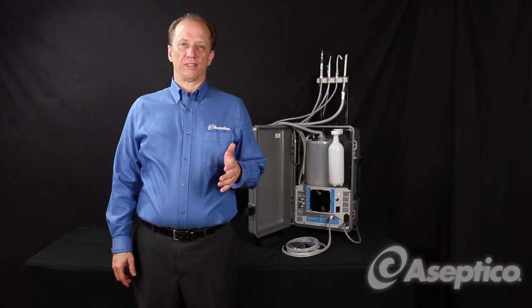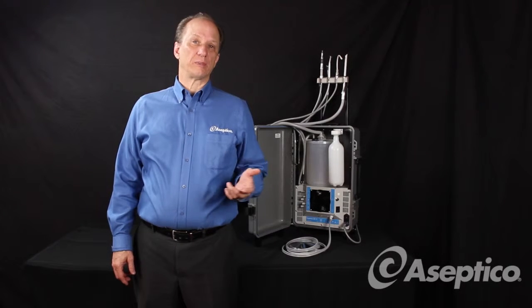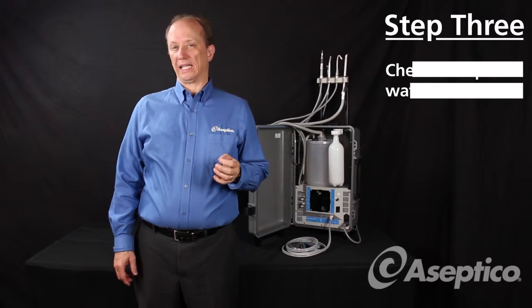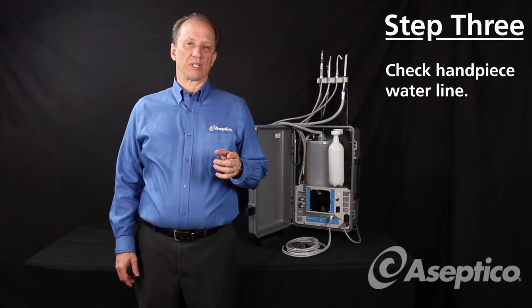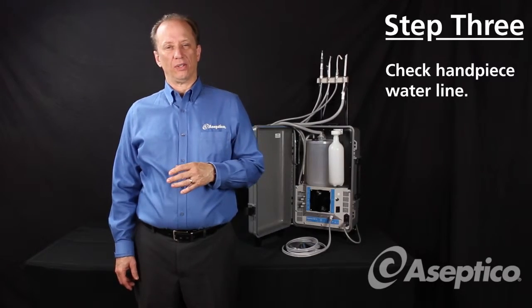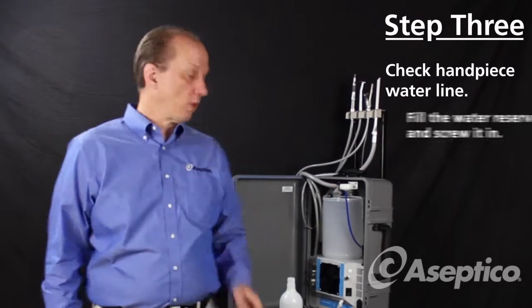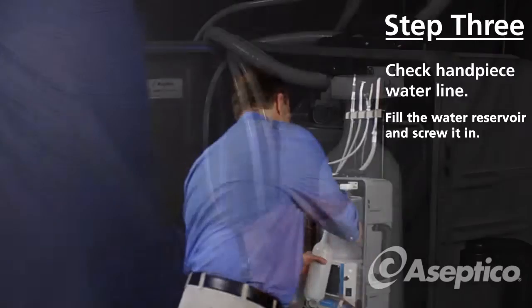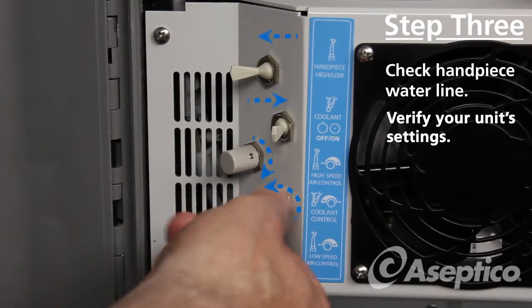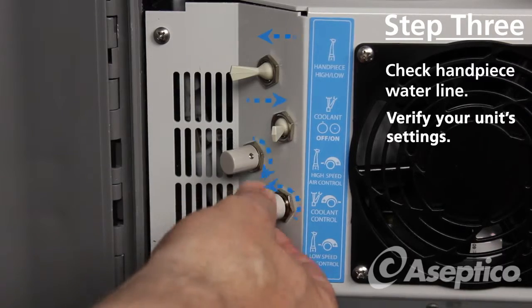If you've tried all of these steps and you're still experiencing issues, the problem might be that there's a clog in the water line of the handpiece. We're going to do a couple of things to determine whether it's the handpiece or the dental unit. Make sure that you fill the water reservoir, and verify that all the switches are set just as we discussed earlier.